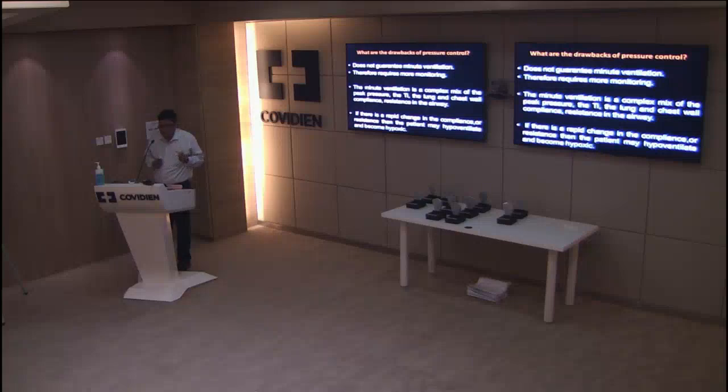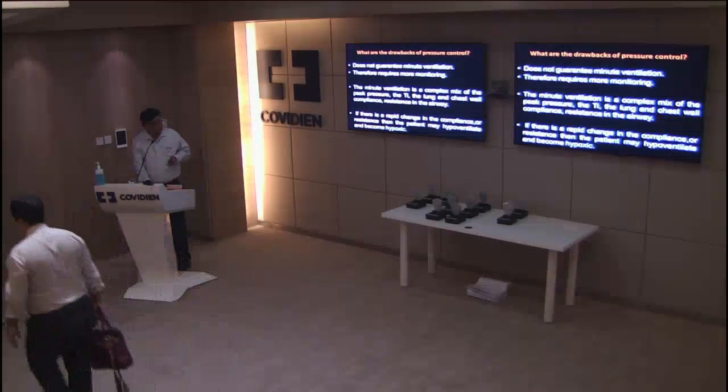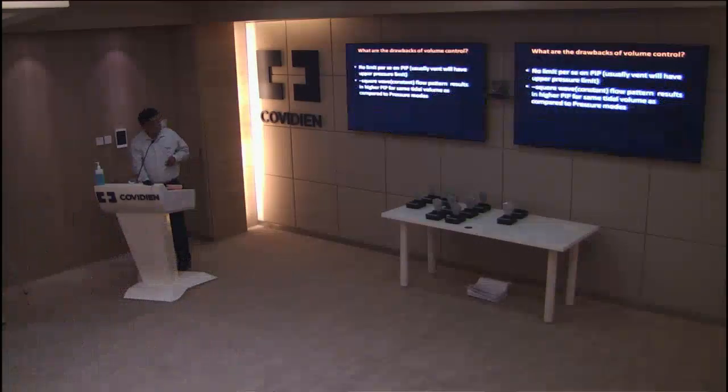The main problem in pressure control is that you have to keep alarms properly, because sometimes with a sudden change in the compliance or resistance of the airways, the patient may not get the tidal volume that you desire. In fact, it might be a little dangerous. So you require a little more monitoring.